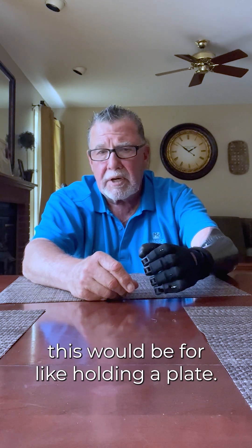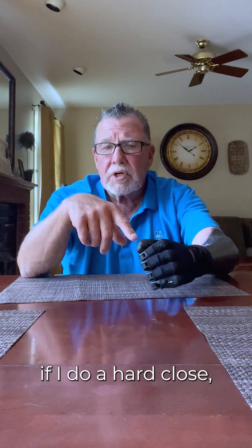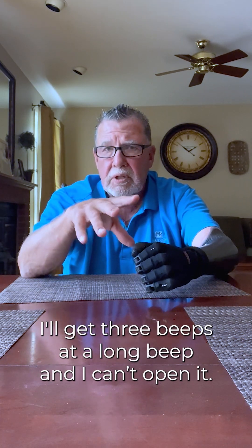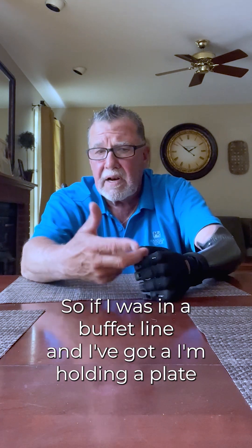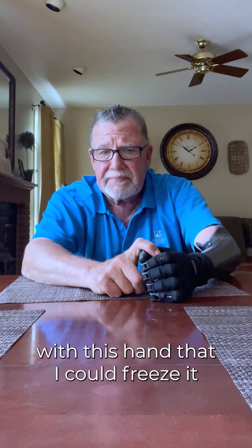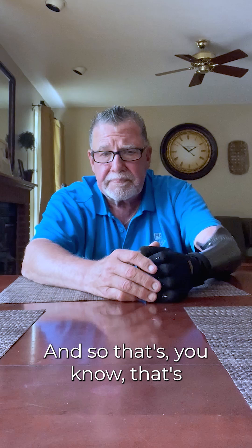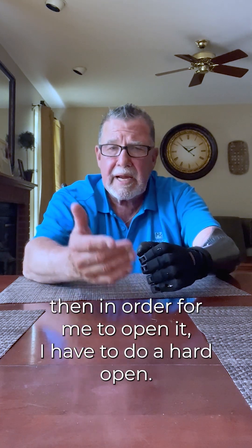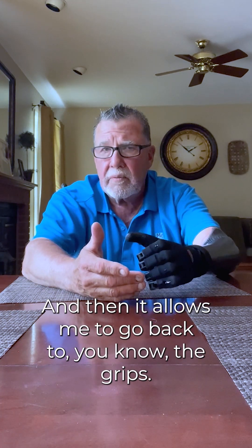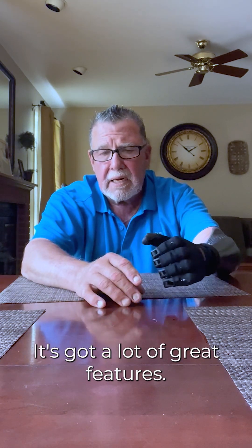This would be for holding a plate. The nice thing about this hand is if I do a hard close, I'll get three beeps and a long beep, and I can't open it. So if I was in a buffet line and I'm holding a plate with this hand, I can freeze it, and I don't have to worry about accidentally opening it up. Then in order for me to open it, I have to do a hard open, and then it allows me to go back to the grips. It's really a very unique hand with a lot of great features.